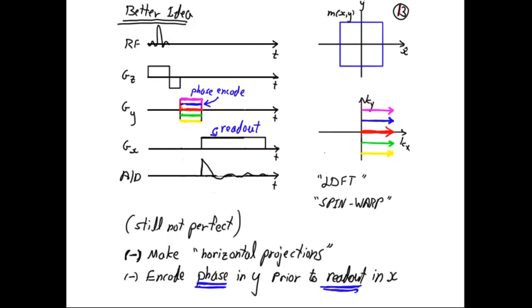Sorry to interrupt. What would happen if you left the phase encode on while the GX was being read out? I know that would be wrong, but yeah, like this, right? Why isn't that done? Okay. So let's do that. Let's see what it traces.